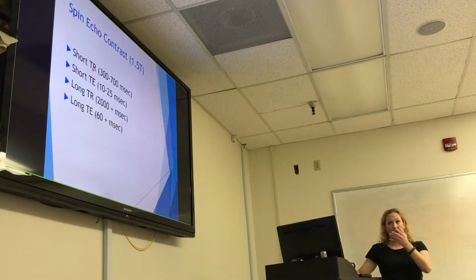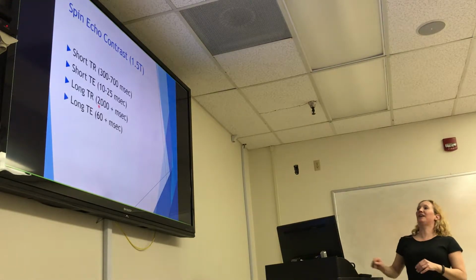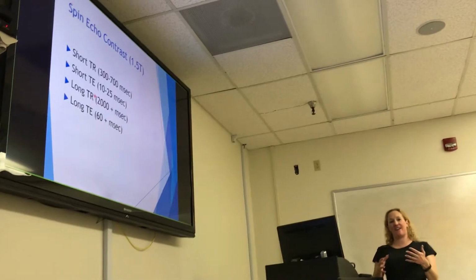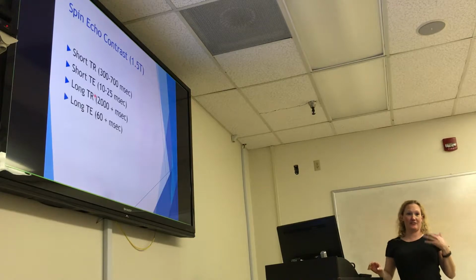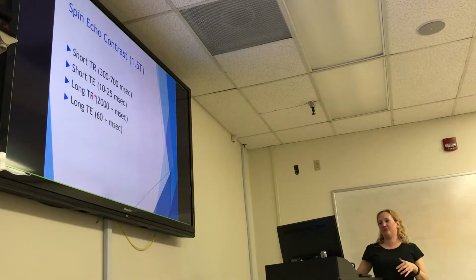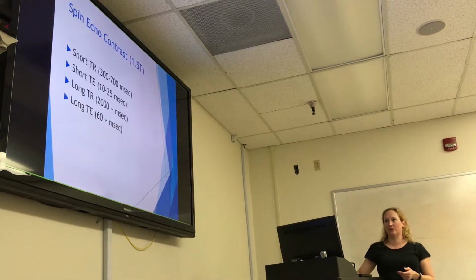Perhaps some of you have already seen the techs messing around with them. They will do that, but they do need to stay within these ranges. I've heard some of their conversations, like, oh man, if we do that, that's no longer going to be a T1. Good, see, and you can see why, because if you added too many slices and now you're above the 700 millisecond range, you're getting away from that T1 weighting that you wanted. So it is important that you at least start noticing what those parameters are on your sequences, even if you aren't changing them yourself.